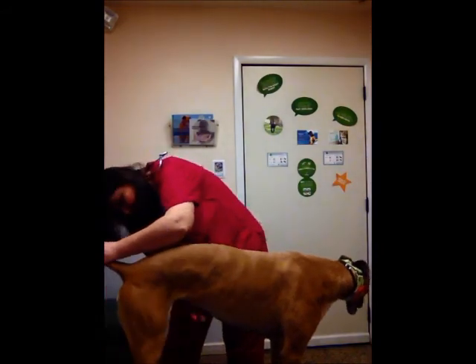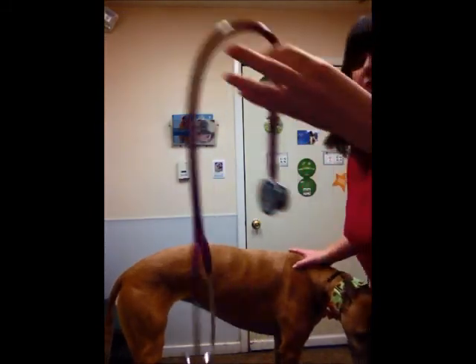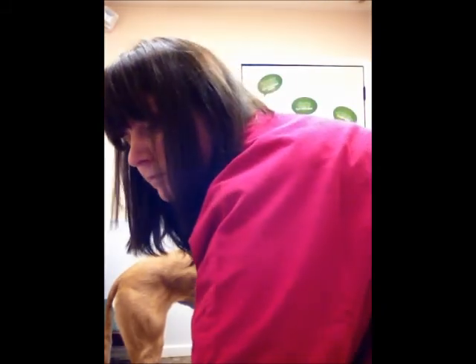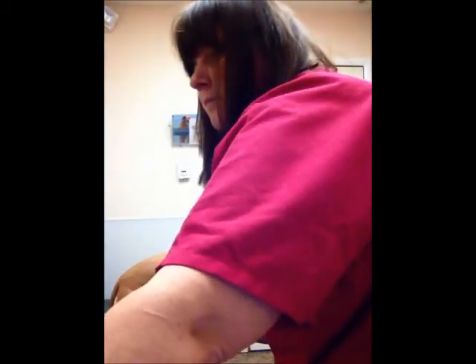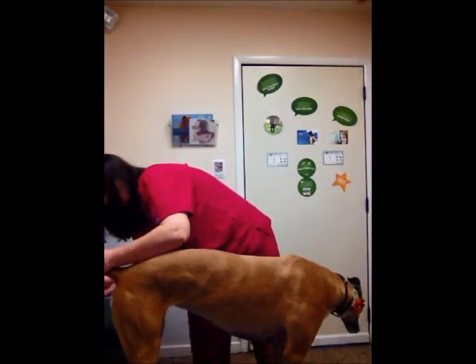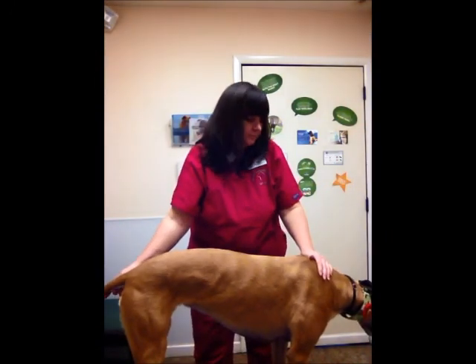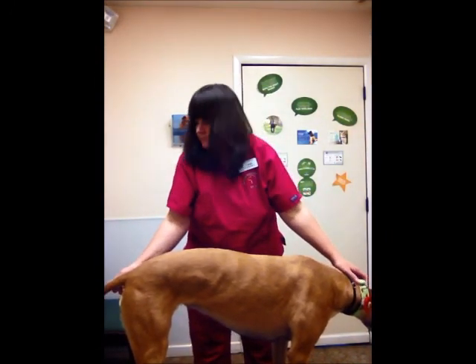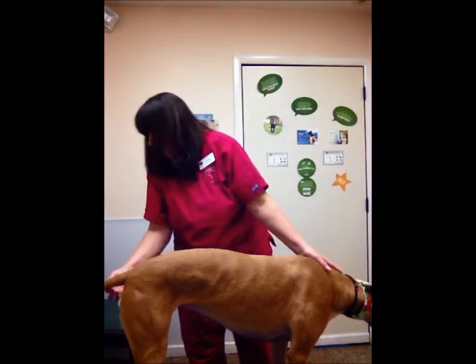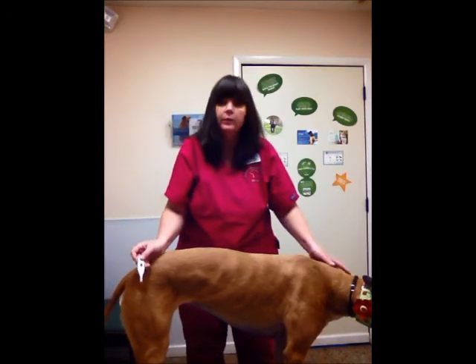Good. Oopsie. One last thing, baby girl. So, to check your temperature. Steady. Blue. Good girl. Good. Temperature is perfect. 101.3.